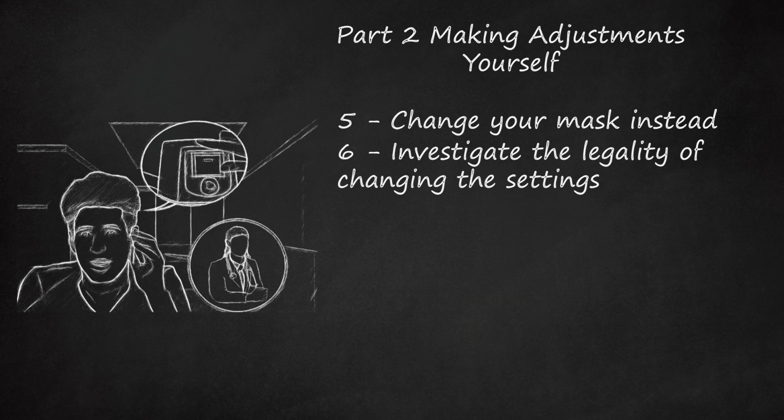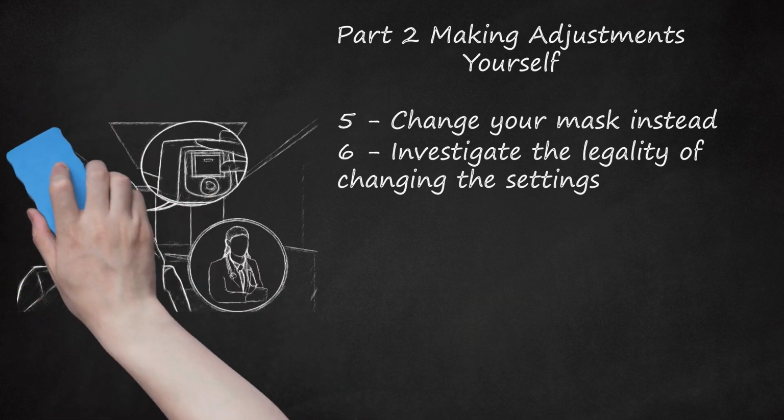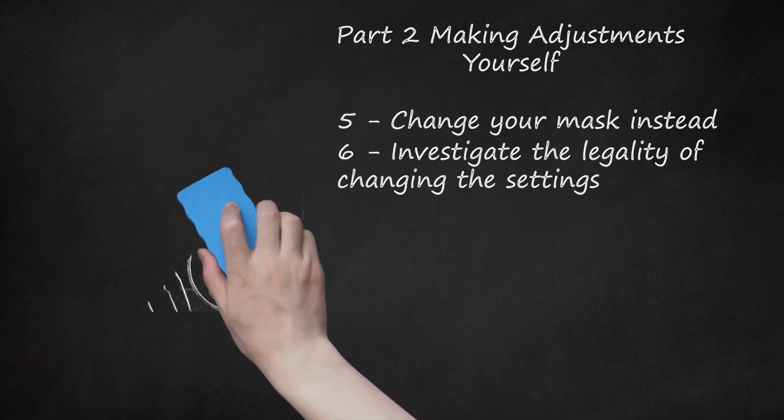If it's a hassle or too great of an expense to see your physician, call and talk to their secretary or nurse and explain that you want to change the settings and need a faxed prescription. Alternatively, call the medical equipment company and ask them to contact the doctor's office on your behalf. Without proper medical training and licensing, changing the settings on a CPAP device can get you into legal trouble, so make sure you know the law in your area.